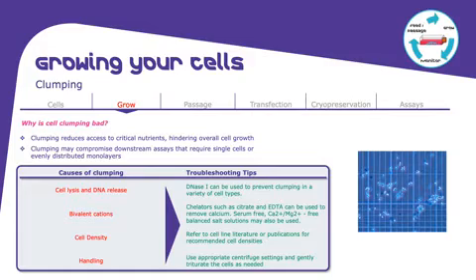Another issue we hear from our researchers is the clumpiness of the cells, and it can really affect the results of your experiments. If the cells clump too much, they don't have good access to the critical nutrients, which can affect their overall expression as well as cell growth. So it is very important to analyze and understand your cells and see how you can prevent clumpiness.